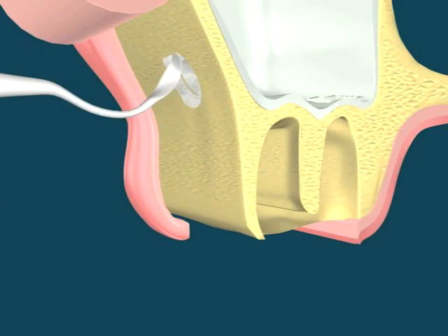The flap is now replaced. The socket in most cases will heal and fill in on its own.